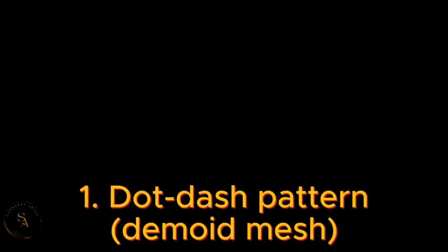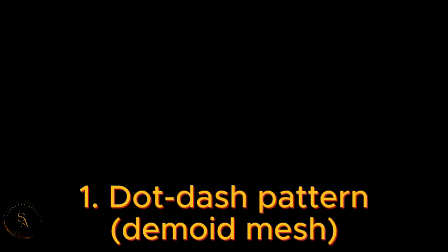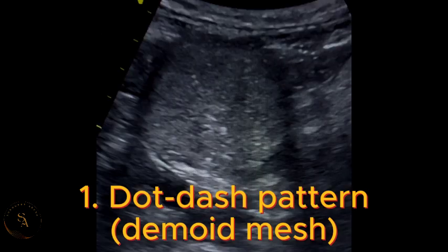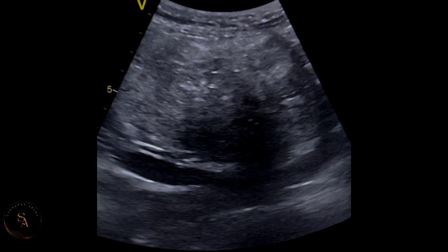The first sonographic presentation is the dot-dash pattern, also called the dermoid mesh. This presents as short and long hyperechoic lines scattered all over the mass, representing the presence of hair, which is one of the components of a dermoid cyst. The images you are seeing are examples of this dot-dash pattern — whenever you see this presentation, you are looking at an ovarian dermoid cyst.